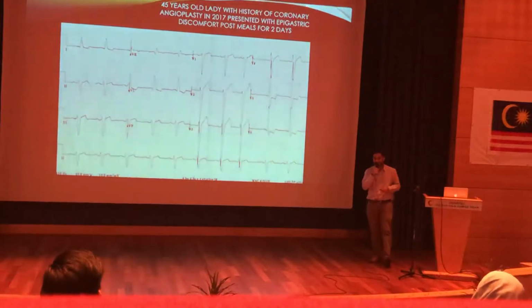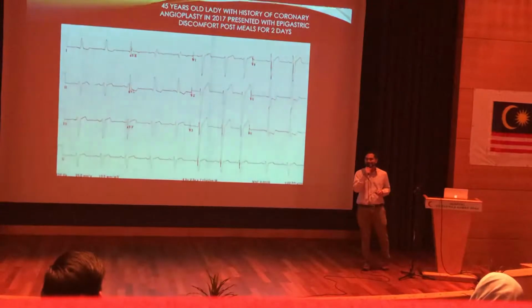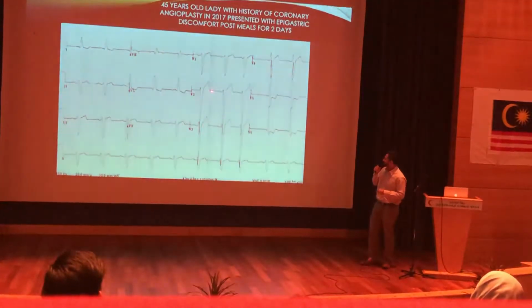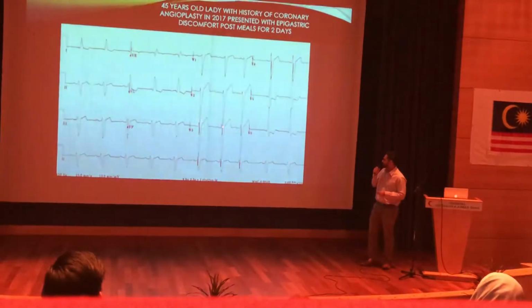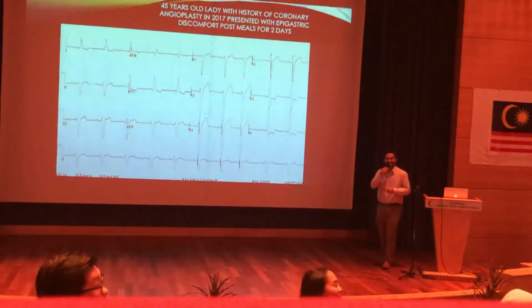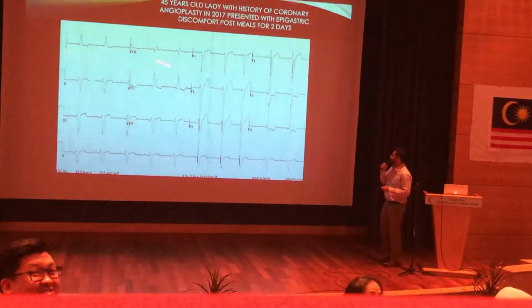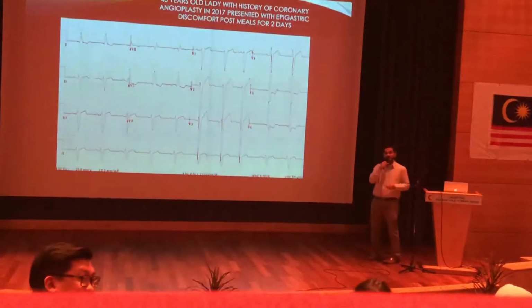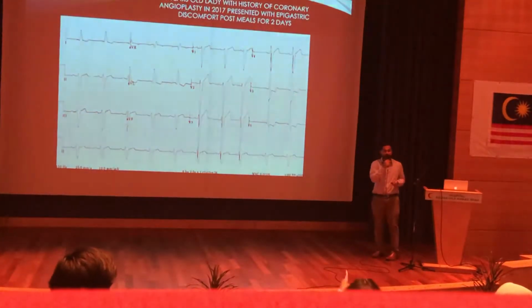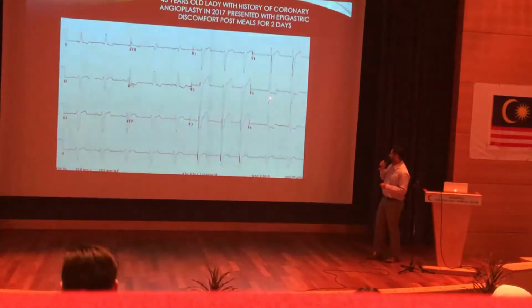Have a look at the ECG. Anybody want to volunteer? Talking a lot today. Come on, guys. Interact. So anything unusual about the waves here? Those at the back. Go on. Anything abnormal there? Will you treat this patient as MI? Do you all see any ST depression anywhere? Where is it? A bit in 1, AVL, V5, V6.